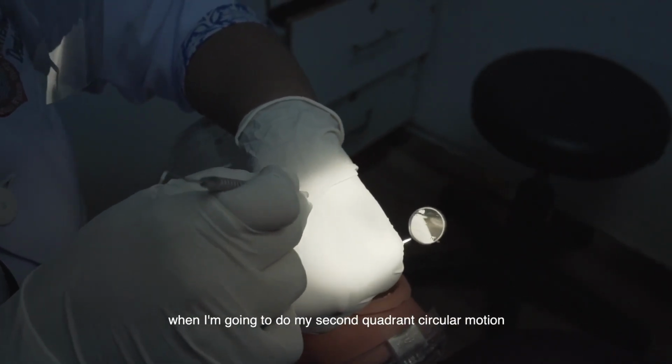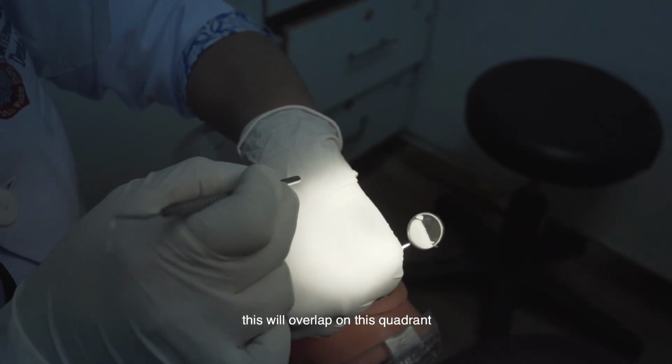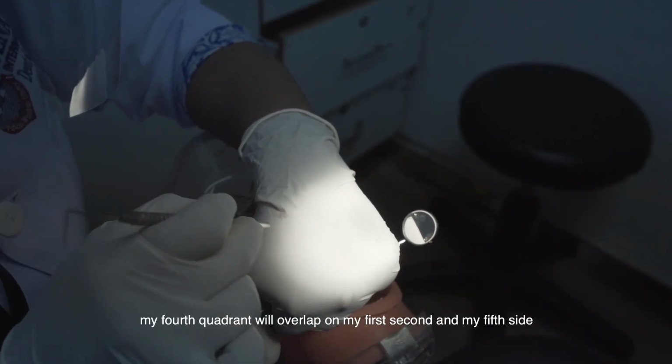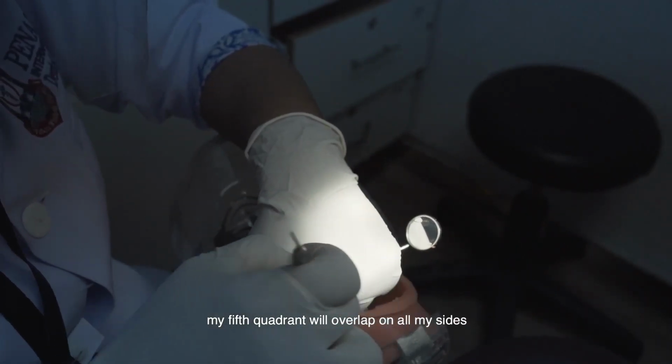When I do my second quadrant circular motion, this will overlap on the first quadrant. Similarly, when I go for my third quadrant, this will overlap on this area. My fourth quadrant will overlap on my first, second and fifth sides. My fifth quadrant will overlap on all my sides.